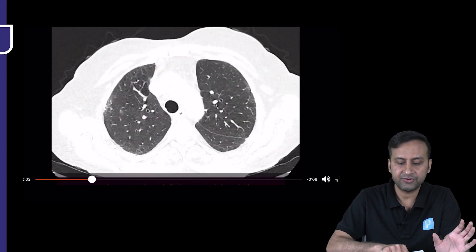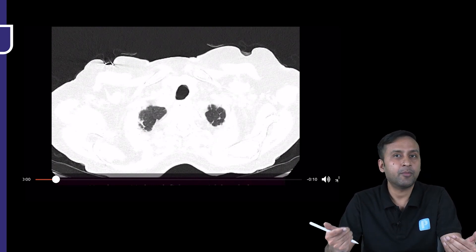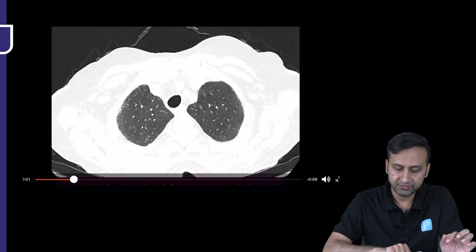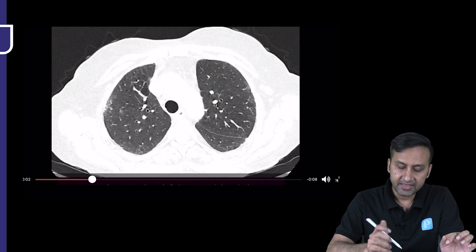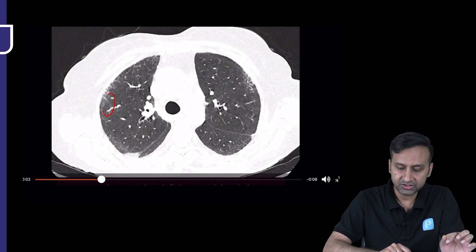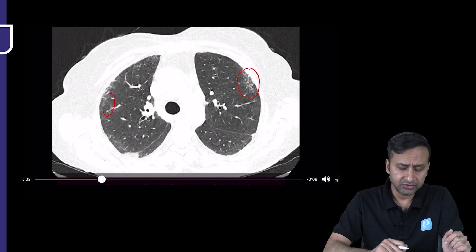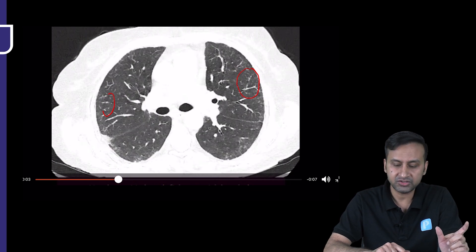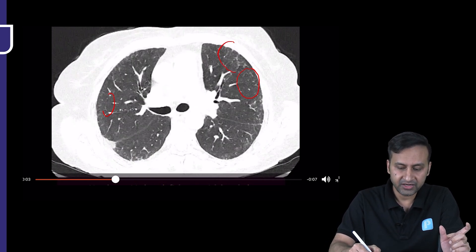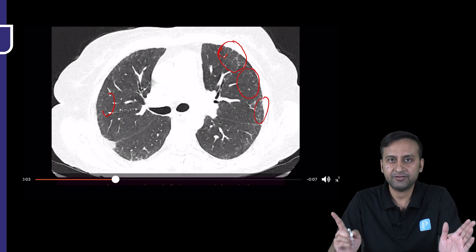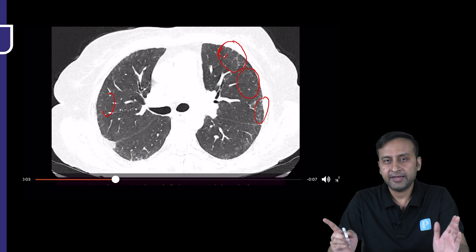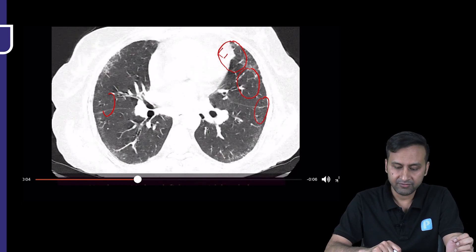The second important question is what are the findings and what is the predominant pattern? Starting from the lung apices, we can see peripheral-based reticulations — an increased number of lines along the peripheral aspects of bilateral lung fields. We are dealing with a reticular pattern. There are no nodules or dots. The reticular pattern is very well seen — there is interlobular septal thickening and a peripheral fine mesh-like network representing intralobular septal thickening.